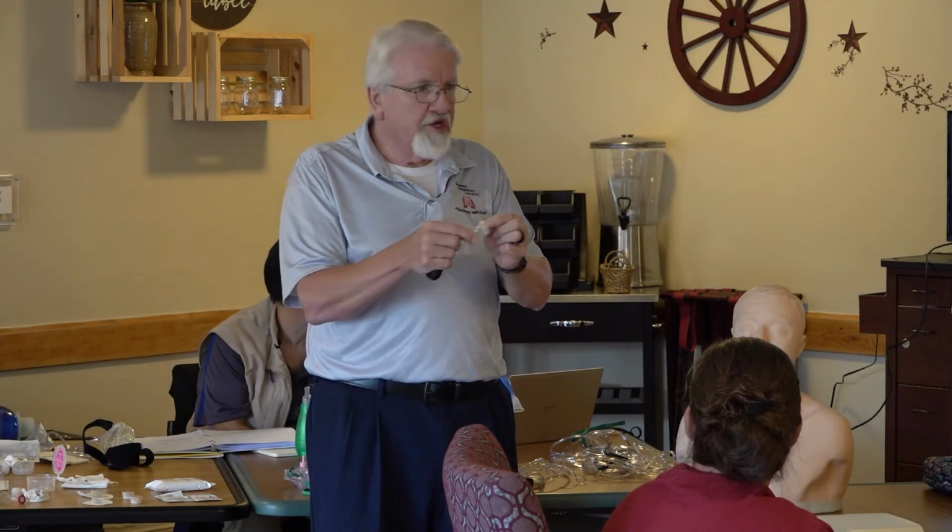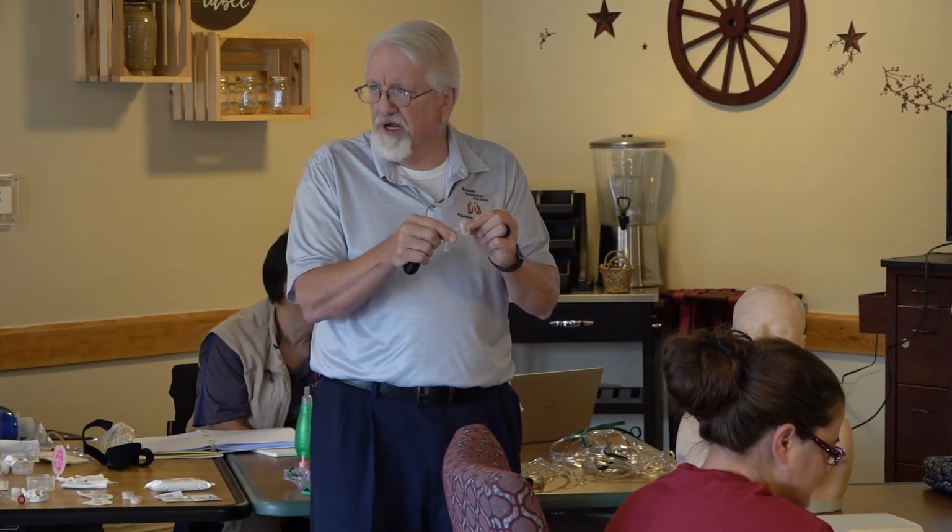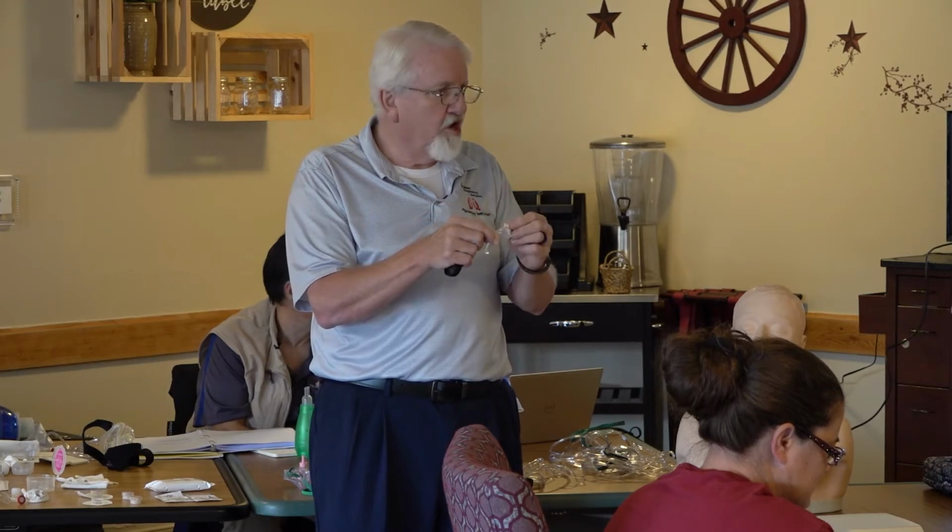So all you're really going to do, if you need to replace the collar, is take it totally off, or just release the collar and pull that out. Warm water, clean gauze. You've cleaned it, it's ready to go back in, and then clean around the stoma with sterile water. Don't use any peroxide, and definitely no aerosols or sprays. Okay? And you're going to reinsert and put the collar back on, and he's done.